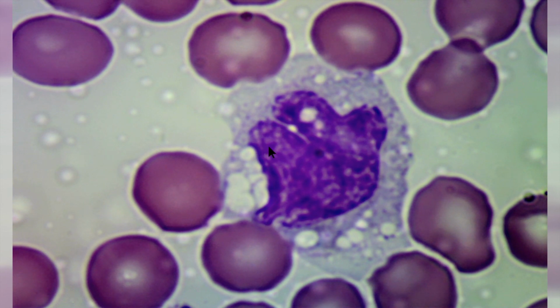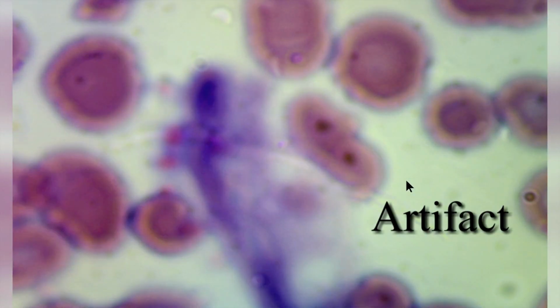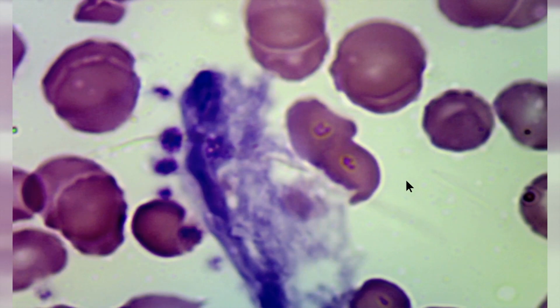The nucleus is kidney bean shaped, but you have to use your imagination a bit. It's a horseshoe, but the ends are very close together, and you cannot see the appearance of a horseshoe, but it appears to be horseshoe or kidney bean shaped in overall appearance. This is a monocyte that is actively phagocytosing some elements in the blood. This is an artifact. It is nothing that needs to be reported.